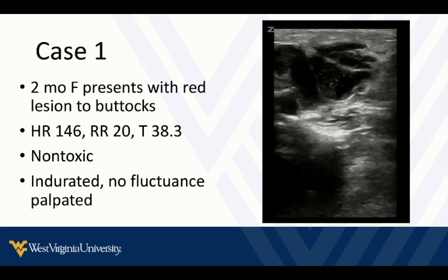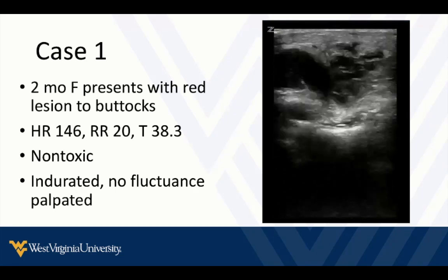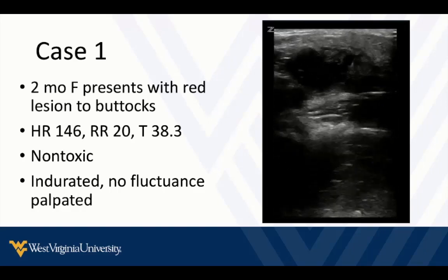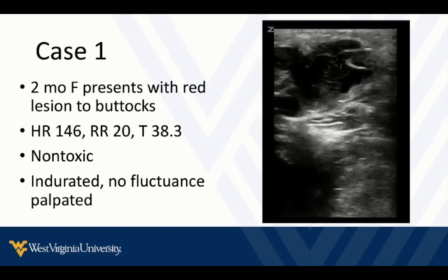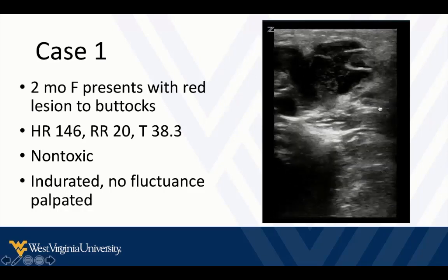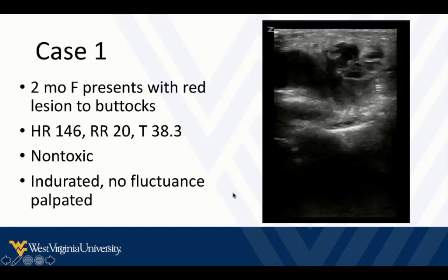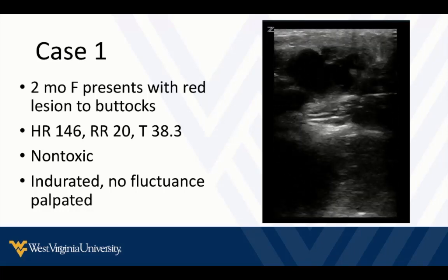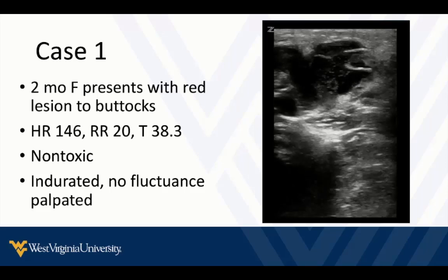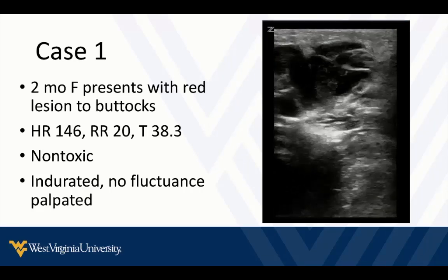So here was the first case we talked about. 2-month-old, looked like cellulitis on the buttocks. We weren't 100% sure. Had to make decisions of does it need an IV or sedation, and how complex is this case going to get? And with ultrasound, able to quickly identify there's a complex loculated abscess in this lesion, so we probably need to take steps to ensure drainage, whether that's a sedation here at the bedside or do we need to arrange an OR case. That's a whole different discussion. But we can't just treat this with antibiotics and think it's going to get better.